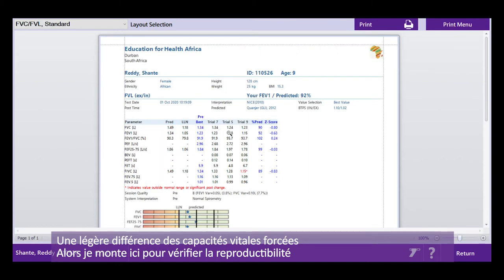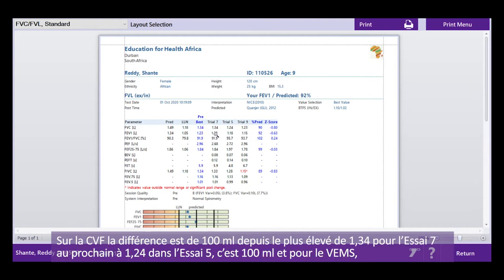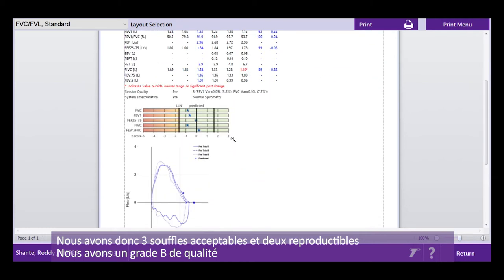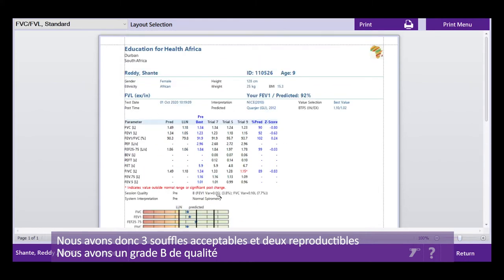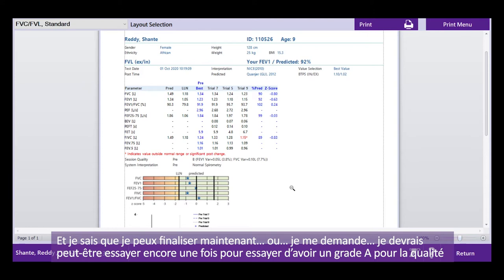I come up and I check for repeatability, and we definitely do have repeatability on this test. I look for repeatability on the FEV1. On the FVC, the difference is 100 mils from the highest, which is 1.34 in trial 7, to the next highest, which is 1.24 in trial 5. That's 100 mils. And then on the FEV1, highest is 1.23 in trial 7. And the next highest is 1.18 in trial 5. That's 50 mils. So there's definitely, we have 3 acceptable and 2 repeatable blows. We have a quality grade B, and I'm happy to finalize this.